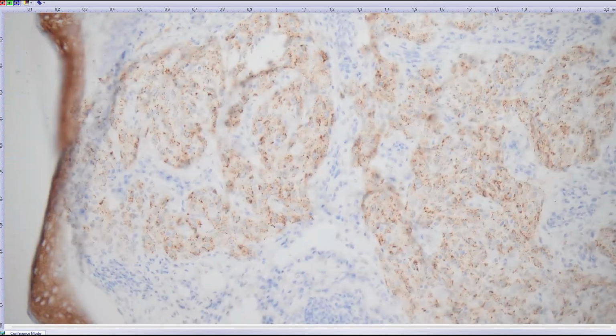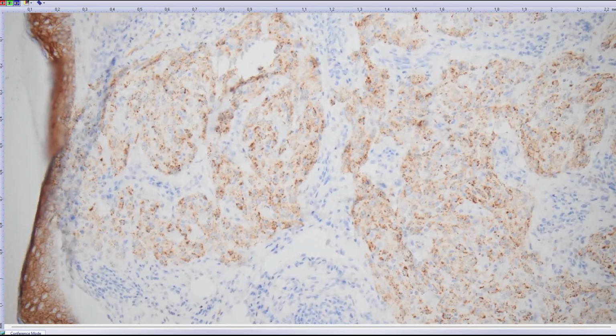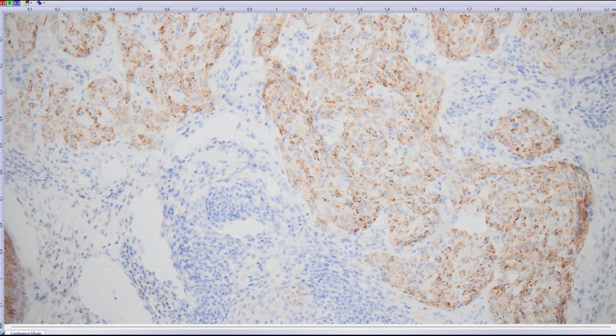And the diagnosis of this is cellular neurothekeoma. I still don't know what these lesions are. I don't think they are peripheral nerve sheath anything. It's an enigmatic lesion, and even in big series, the authors didn't find one specific nature of these.